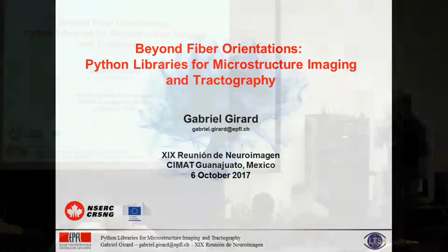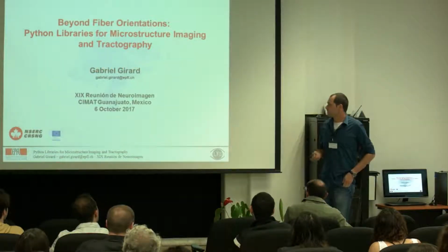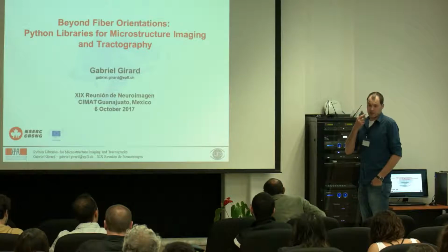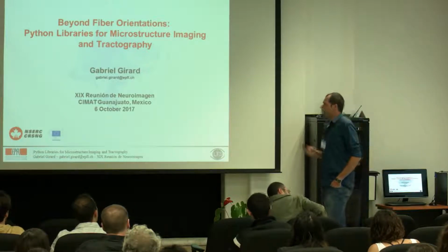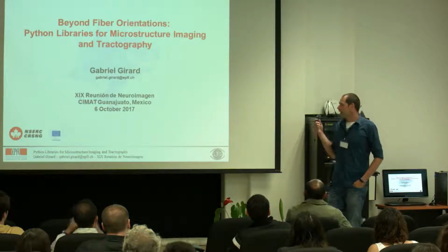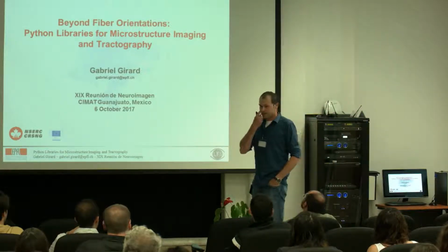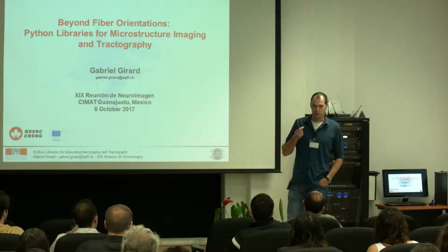So Alonso asked me to do a more hands-on session on the tools I showed you yesterday, and I figured it's quite hard to do it and be entertaining. Since I want to go into the code and how to use the tool, I would like the session to be more interactive, if you will.